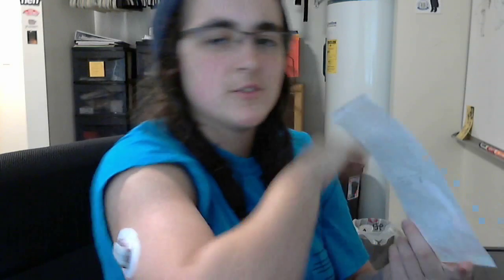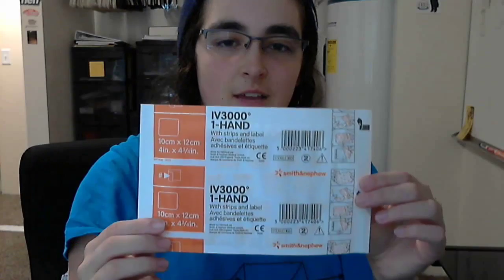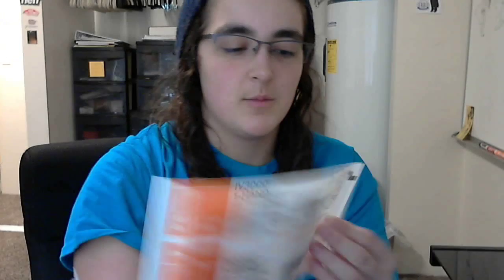I do one final step. I use this IV 3000 tape. I order it on my Medtronic store. So I also use the same thing for pumps, but they have a special pump site one. But this is just 10 centimeters by 12 centimeters, or 4 inches by 4 3/4 of an inch.